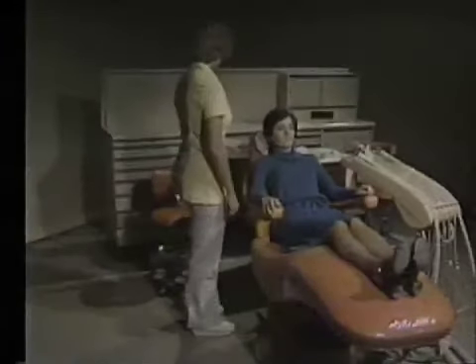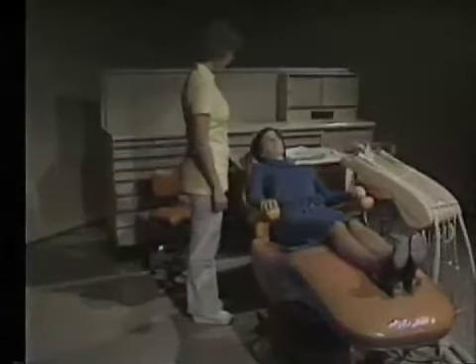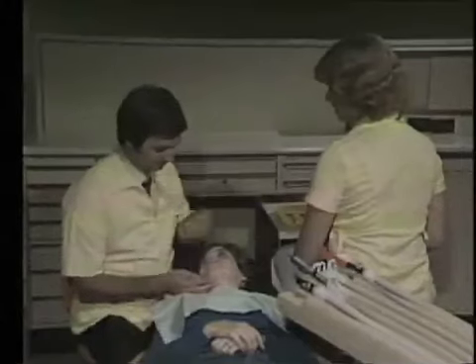Lower the chair back slightly and pause a moment to give the patient an opportunity to adjust to this reclined position. Continue to lower the back of the chair until the patient is in a relatively flat or supine position. The patient is then lowered into the operator's lap. Final adjustments can be accomplished by having the patient's head turned toward or away from the operator, or by tilting the head up or down.